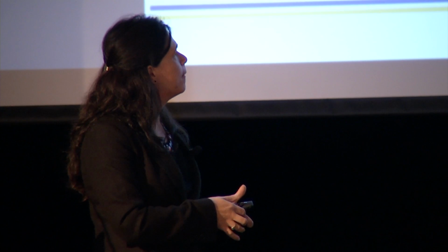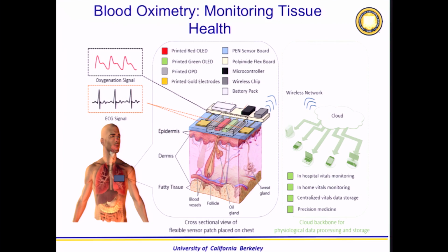So what they want is to have a device or a blanket that is flexible or a bandage that is flexible that can cover a large area of the body and it can map the local oxygenation. So imagine doing this with the current technology. You would need so many LEDs, so many photodiodes, it would become so expensive that people wouldn't be allowed to use it in the hospital. But with the printed electronics and the large area aspects of being able to distribute these devices over flexible substrates and large area, we believe that we can do this measurement. And you can see we can provide this for the doctors.